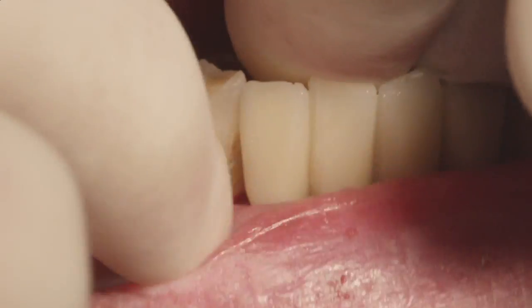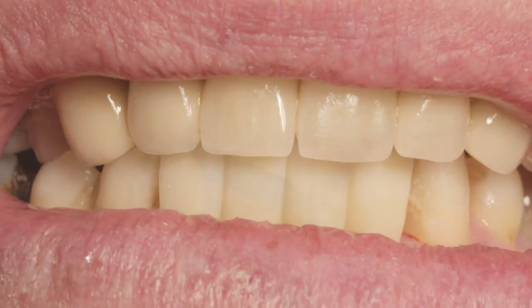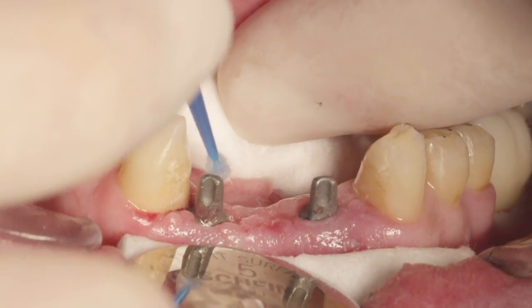The prosthesis is placed back onto the fully seated abutments and the contacts are evaluated. The prosthesis is then removed and a metal primer is applied to the milled abutments.